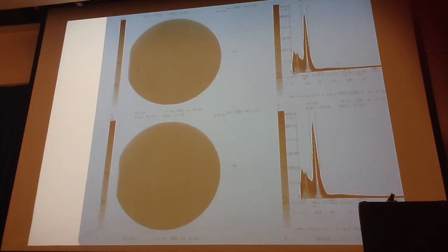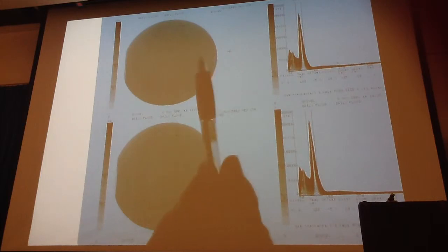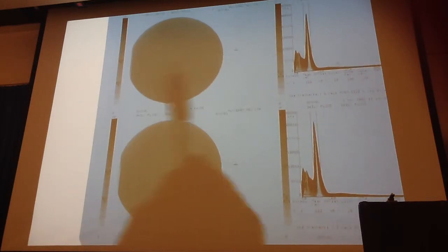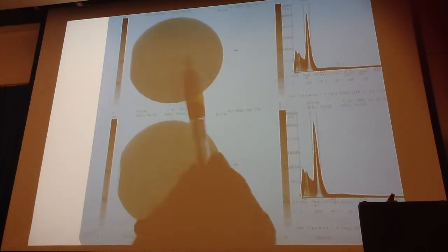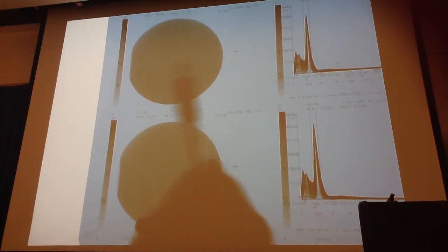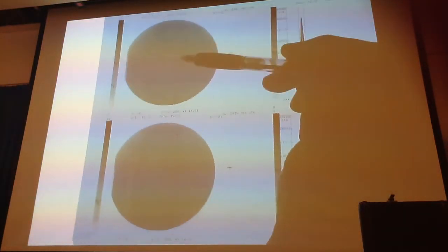We have what they call an X and a Y gain. Remember those amplifiers we talked about that determine the location? You have to periodically adjust them to make sure that you're seeing the whole field of view. And in this one, the X gain is too amplified. That's why it's projecting the image off the end over here. All of the patients that you would image on this camera are going to have an elongated width. Everything is going to appear wider. If we had this problem in the Y direction, then everything would be taller and thinner.